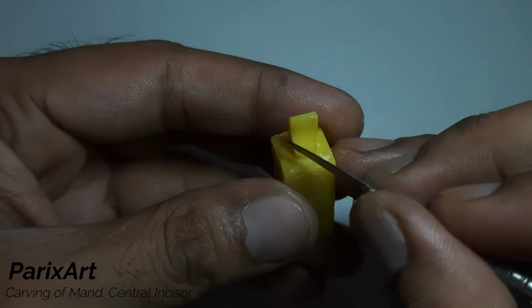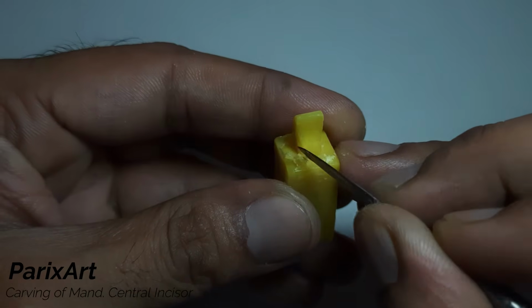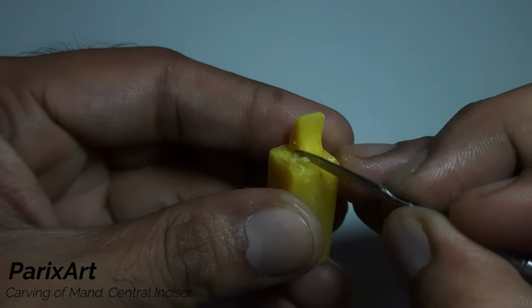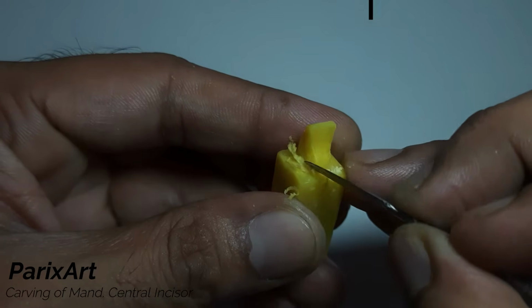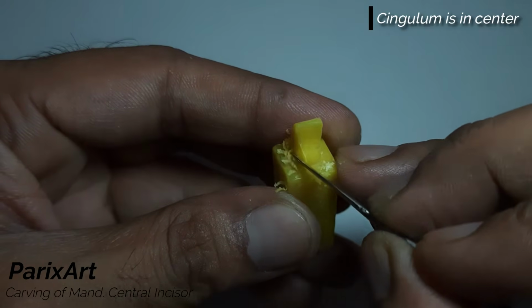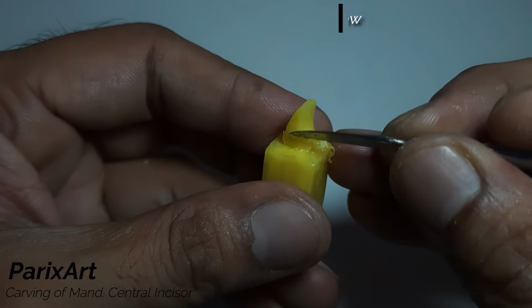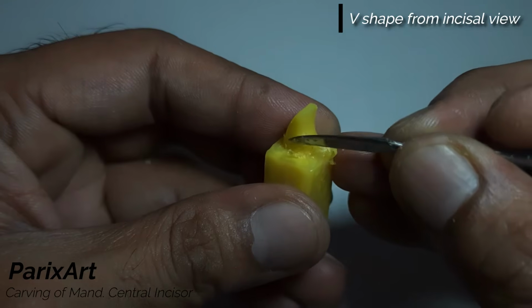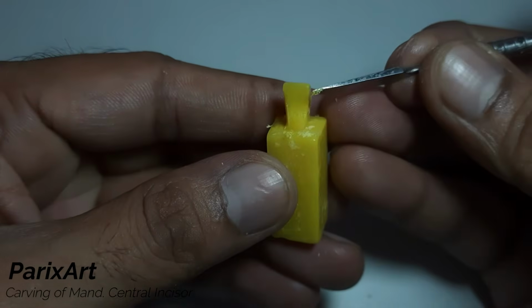So let's carve. The angle of the carver is same as that for the maxillary incisor, that is from incisal to cervical towards the midline. Do the same on the distal side.